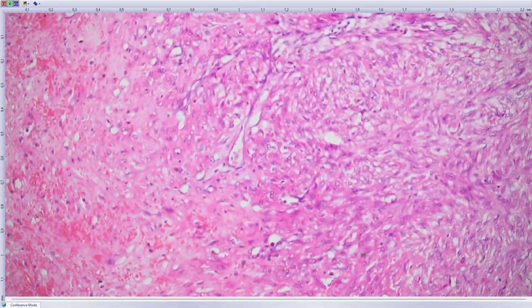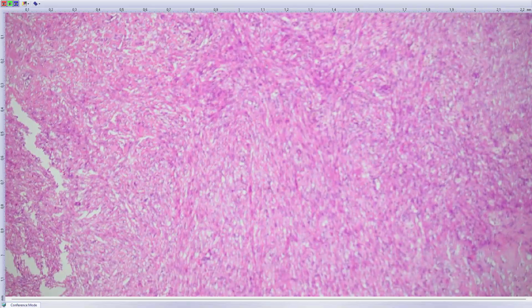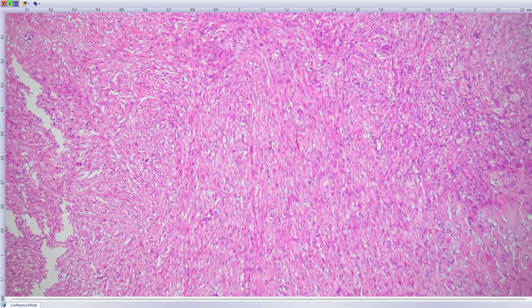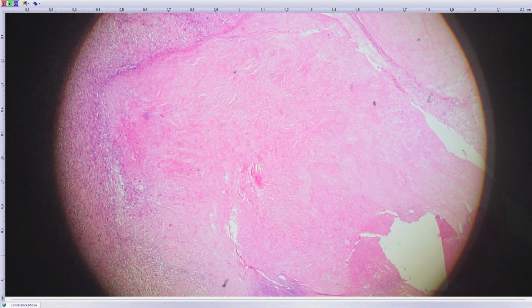The patient, I think she gave birth recently, so she was undergoing some pretty major hormonal changes recently. And it was obviously sent with the question whether this is a tumor necrosis, and this should be called STUMP or even leiomyosarcoma, or whether it's just this hyaline necrosis associated with hormone changes and sometimes occurring in young patients.